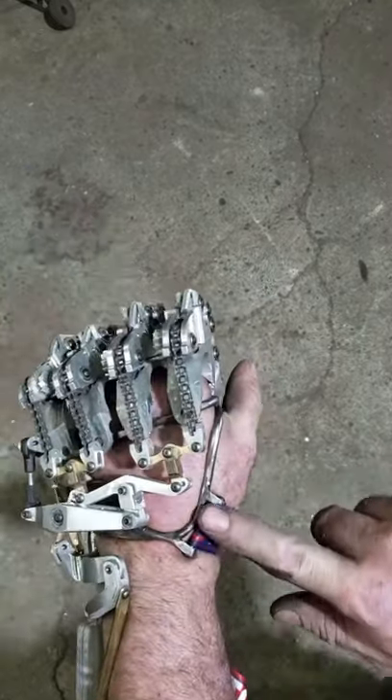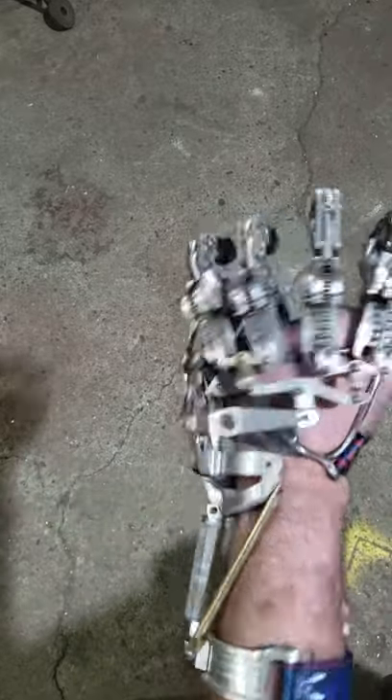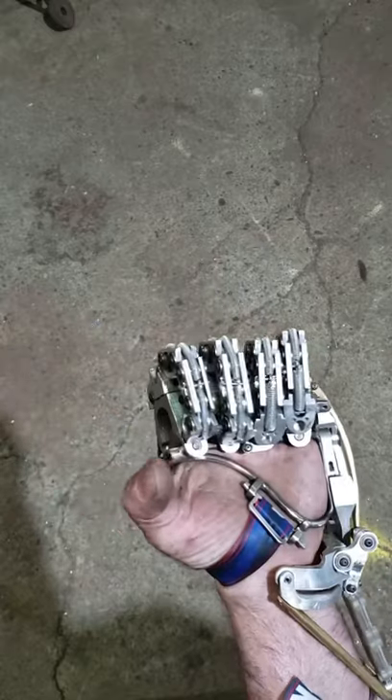And then an Arduino and a display right here with the batteries on the forearm also. Let me know what you think.